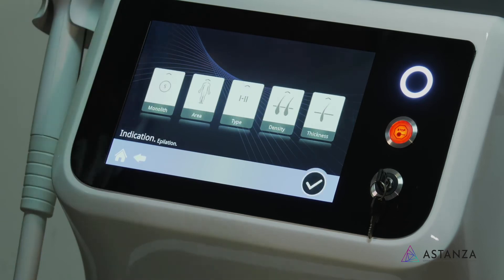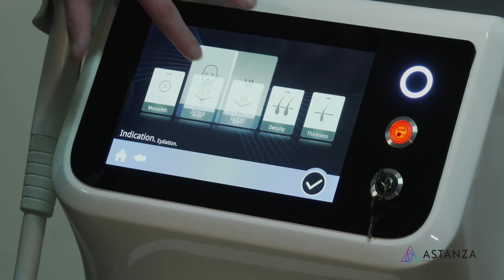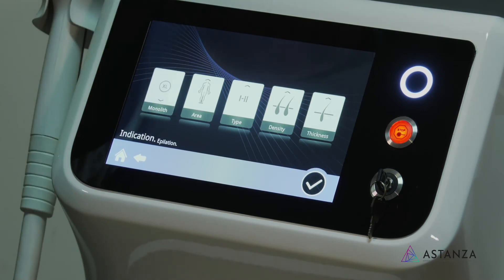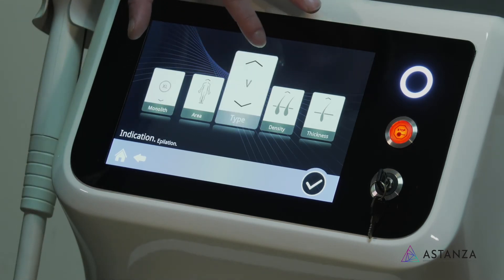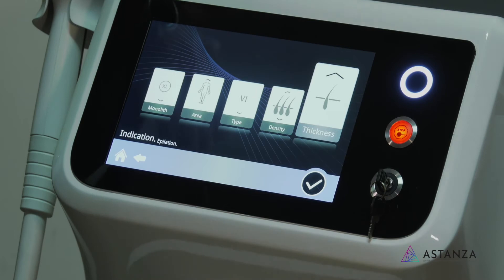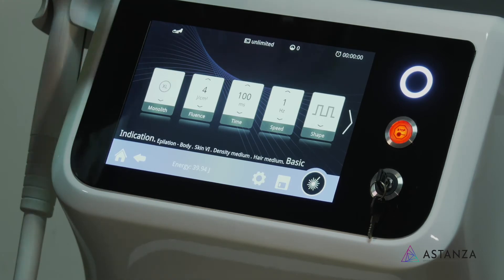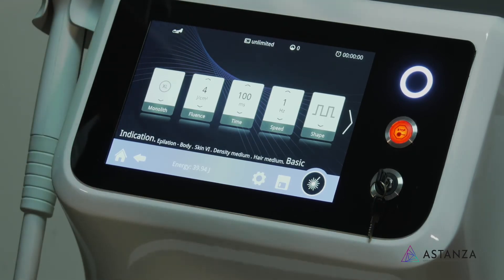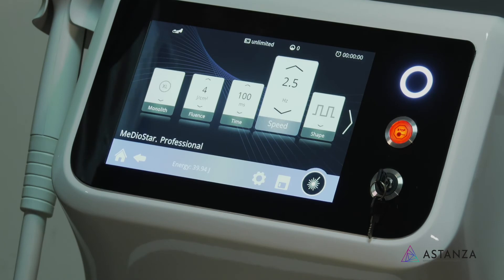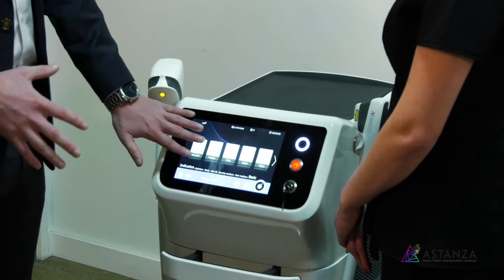If we're looking at skin type six — everybody wants the ability to treat even the darkest skin patients. We come up to skin type six, area of the body is going to be legs, and we'll use the extra large handpiece. The density of the hairs is about average. You can see the fluence level is down and we've shortened the time duration to accommodate that. Speed is always going to be one, but it's up to you as a practitioner. The machine knows exactly what you're looking for and will pre-populate those preset settings.